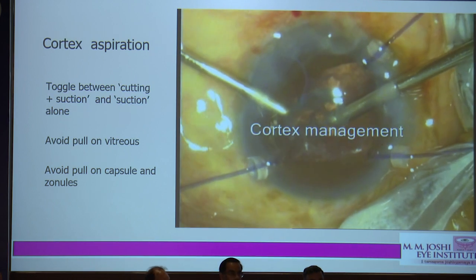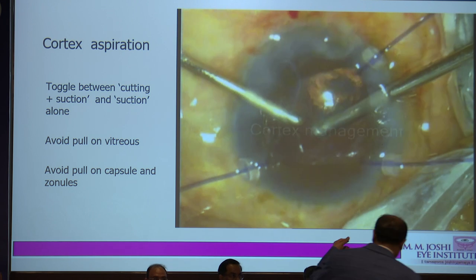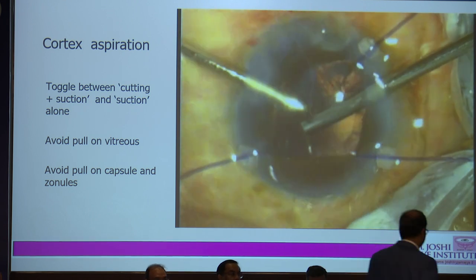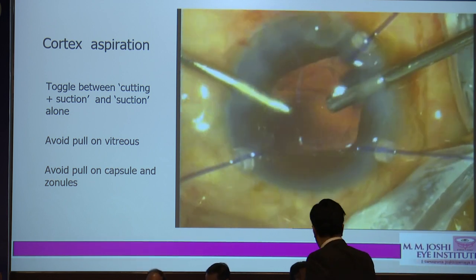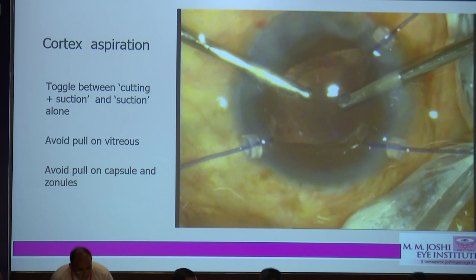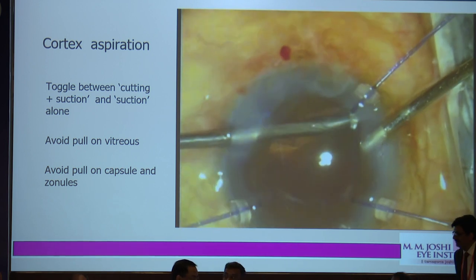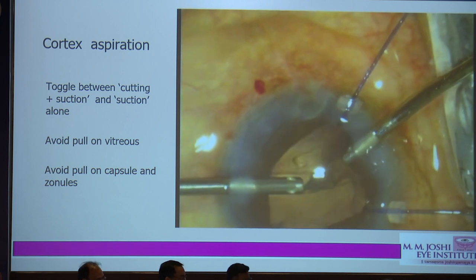Then comes the important point, the cortex aspiration. So the toggling between the cutting and the suction alone, that has to be managed. So I always suggest my fellows and the residents to keep the cutter on the side, not at the down, not at the up, on the side, so that whatever vitreous is there, comes to you.